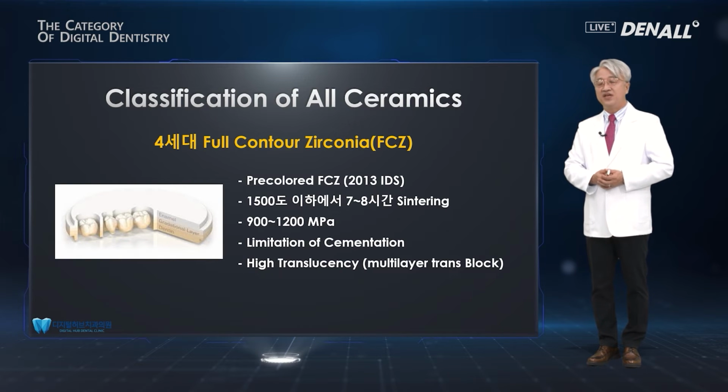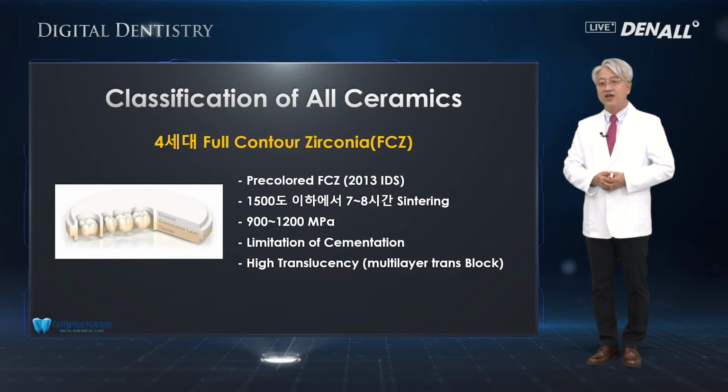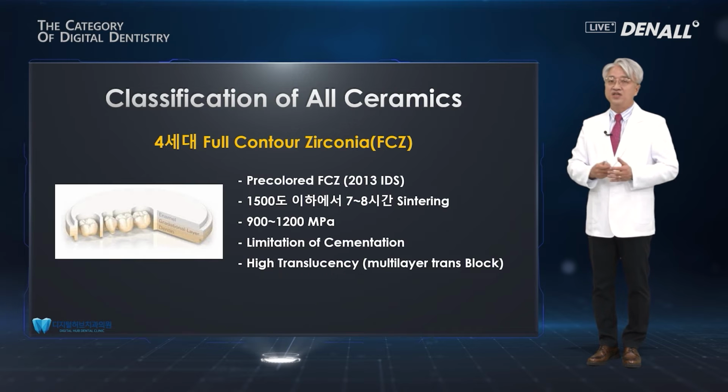Except compared to resin or ceramics, in terms of cementation, it's not resin cemented. So compared to resin cement, now I think GI cement is mostly used. But I think overall clinically there's not much of a problem.